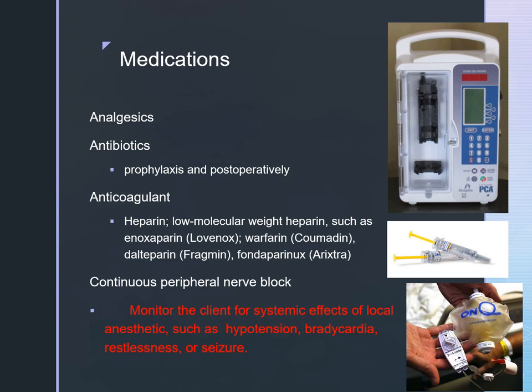We can give our patient a PCA pump, which is what you see in this upper right. We're going to insert the syringe that comes from pharmacy, and the patient has a button and they're allowed to give themselves a small little dose of medication, usually every 6 minutes or every 8 minutes. The big don't on this one is to ask the patient's family members to hit the button. Only the patient is allowed to hit the button. Is the nurse allowed to hit the button for the patient? No. Well, what if the patient's not cognizant enough to hit the button? Maybe they have a baseline altered mental status. Well, then they do not need the pump. We need to abort that protocol and allow the nurse to use their judgment to assess the patient's pain and administer pain medication.